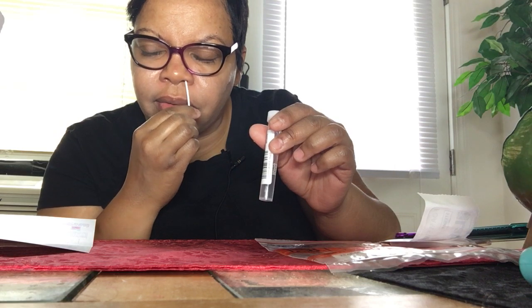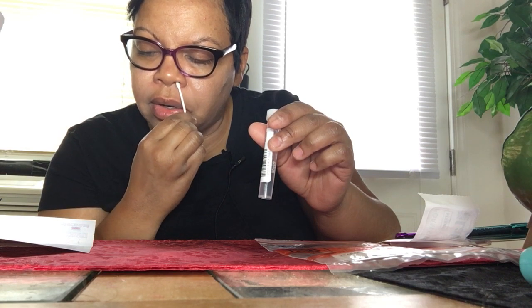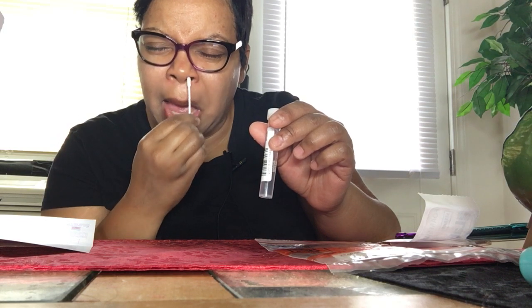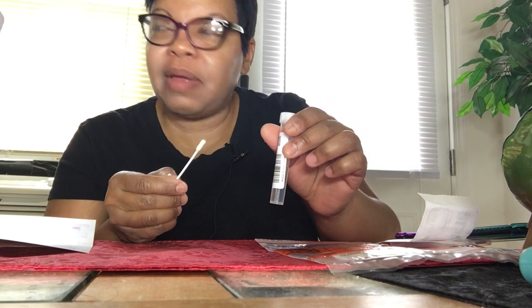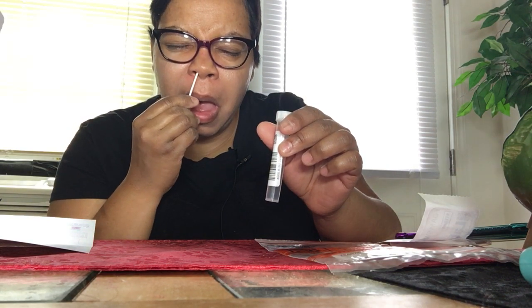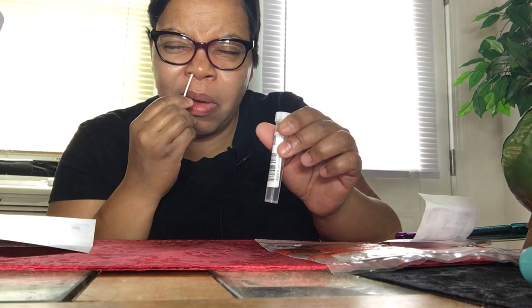This is grody, yo — grossy grossy. It tickles. Rotate, rotate — I'm doing it more than three times. Ugh, yuck yuck yuck! Whoo, makes you want to sneeze. Now you gotta do the other one. Gosh, I can't imagine them pushing that thing all the way back like that, oh my gosh.